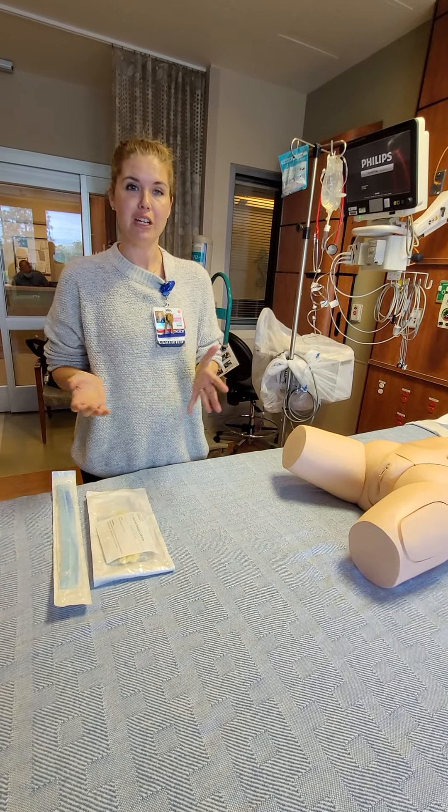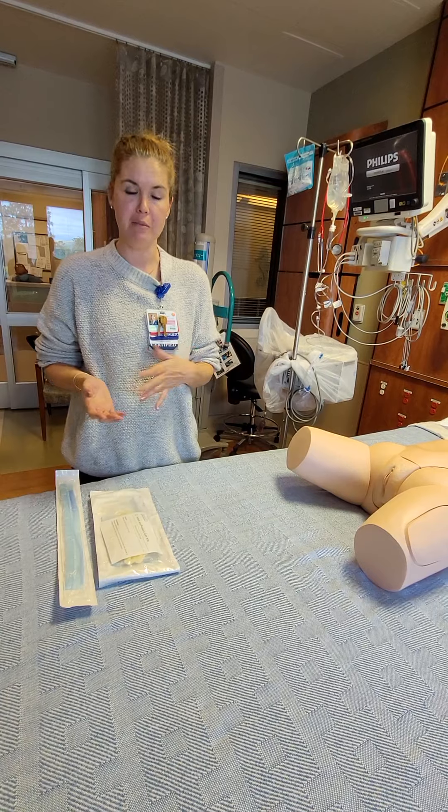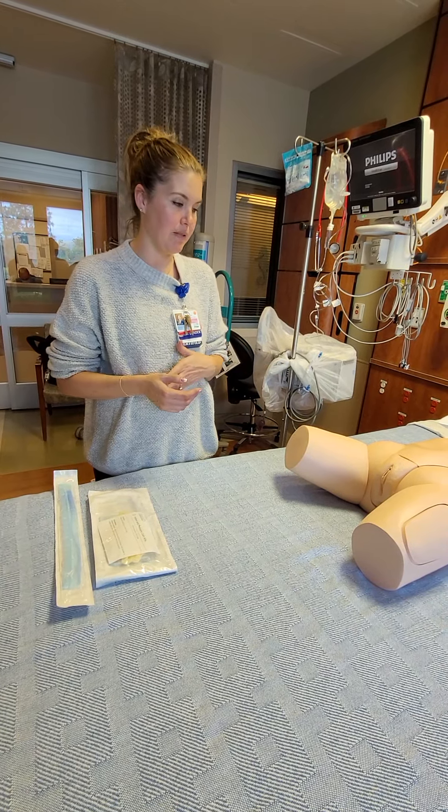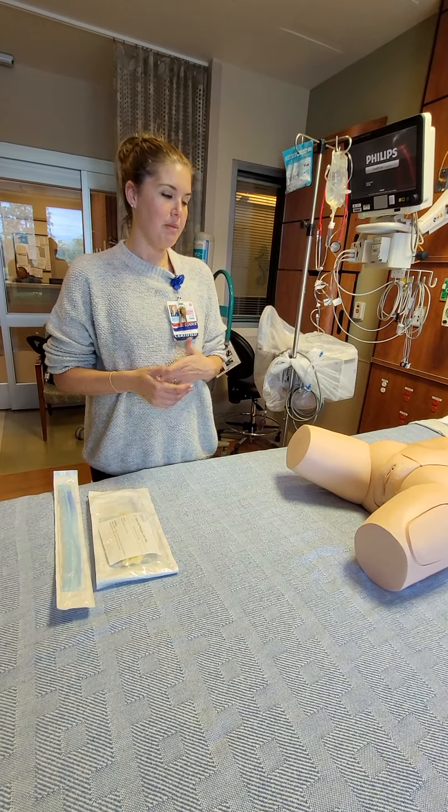I'm going to walk you through a VCUG, or voiding cystourethrogram. You may get a call from IR to help come with a pediatric patient that needs one of these. Basically, it's a radiology procedure done with fluoroscopy to visualize the bladder and the urethra of a pediatric patient, maybe for someone who's getting chronic UTIs. I'm just going to show you what supplies to grab and how to set this up down in IR.